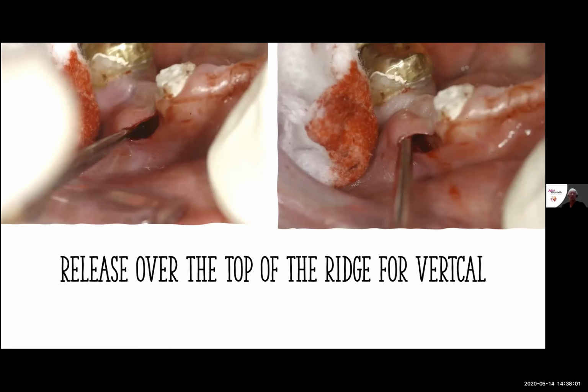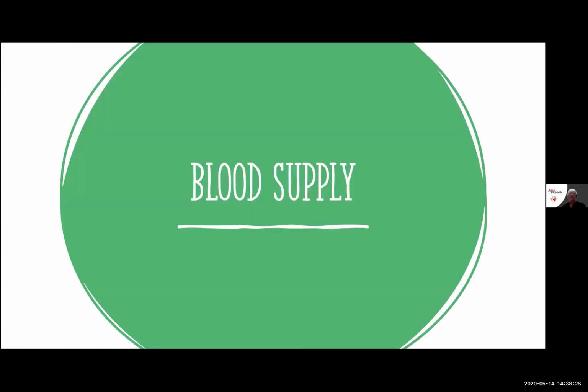If you need to create some vertical, you would take your same 2-4 Molt and then go over the top of the ridge. And so as you're releasing the keratinized here, you can then go over the top of the ridge as in this example here. And then as you've released this, now you've created a space that we're going to be able to pack bone into. And as we pack bone there, we're going to be able to get growth that's going to happen in the vertical direction. Blood supply. How do we get blood supply in the tunnel?